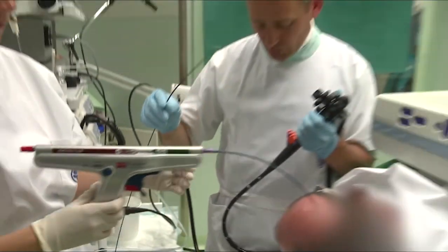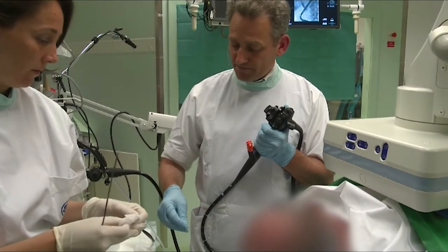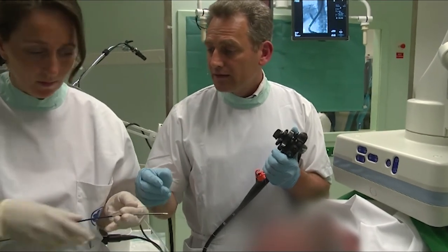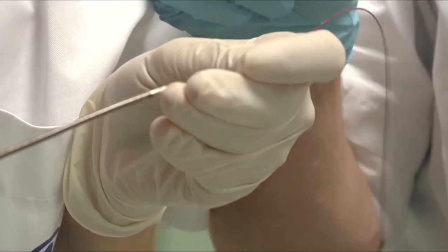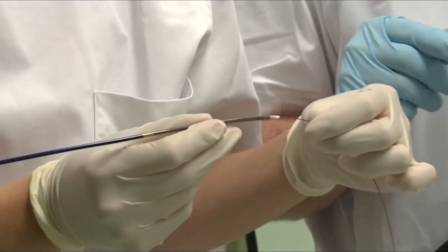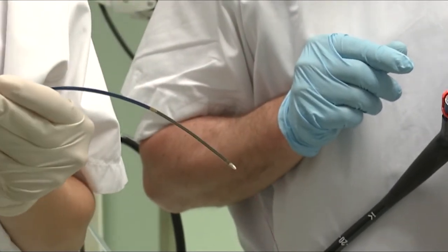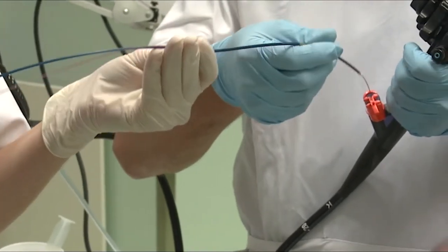So let's now introduce the stent into the patient over the wire, and we can see then the wire exiting the catheter at the zip port. In fact, there is a small portion on the stent which is transparent, so you can already see the wire just before it will exit the catheter through the zip port, just as a kind of visual aid to mount the introduction device.